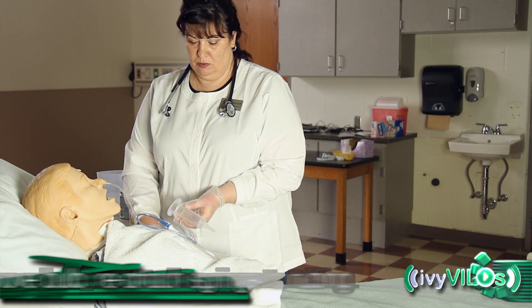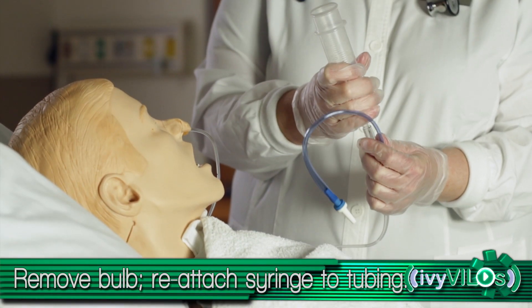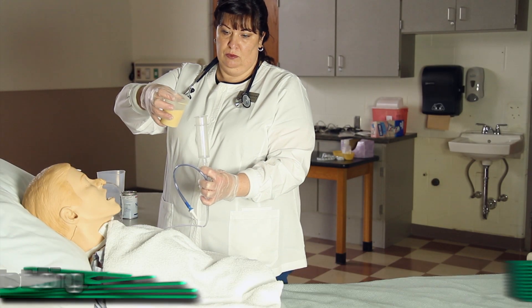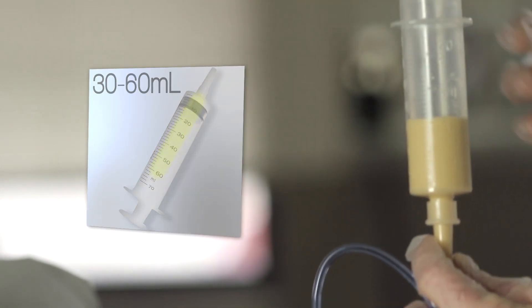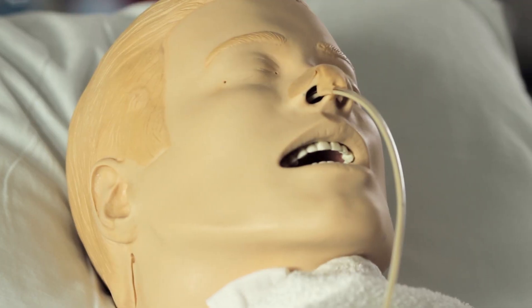Attach bulb syringe to NG tubing and remove bulb. Pour feeding formula into syringe, 30 to 60 milliliters at a time. Adjust height of syringe so formula steadily flows through to the patient.